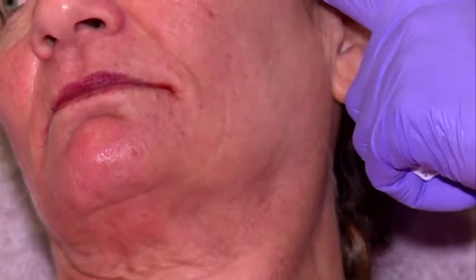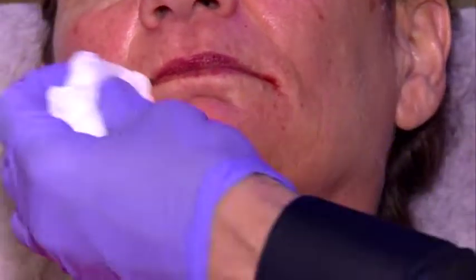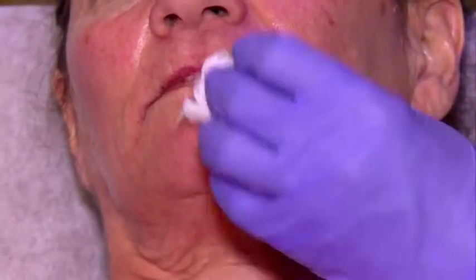Do you want to do the other side as well quickly on the temples? No, I think I've got the patient ready for lips in a minute, so you can finish off if you want to. How are we doing for time? Can Torsten finish the other side, do you think? Or I can show you how. Okay, fine. Then I need one more Belotero and my cannula. Volume. The same. Are you doing good?